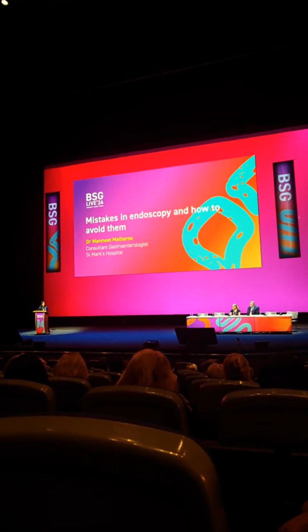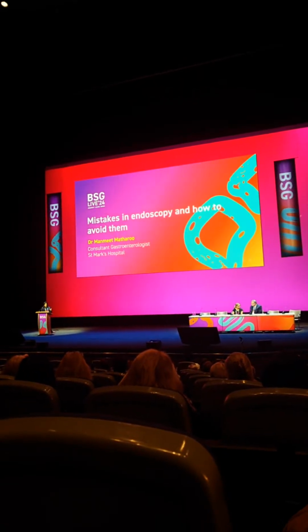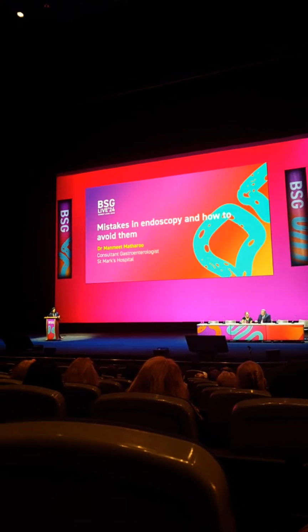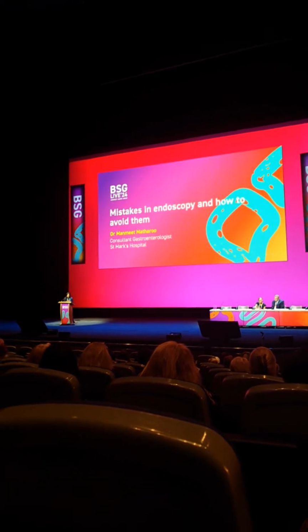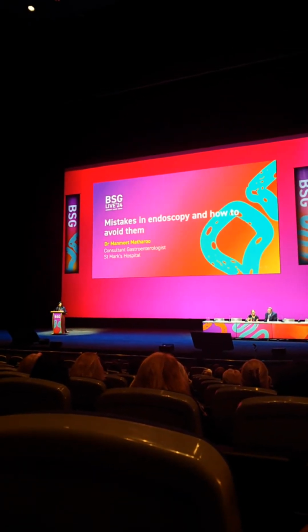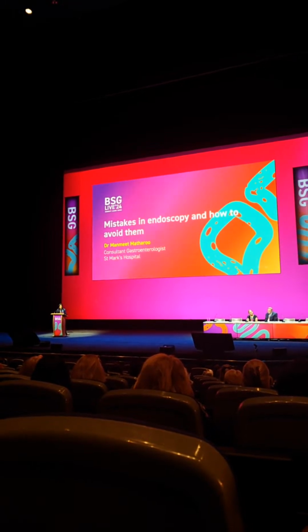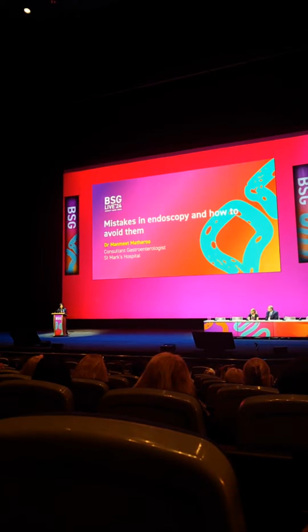Really important question. So as part of my research, we actually timed the length that a checklist took to add onto the procedure, and on average it was about 36 seconds. So the checklist itself didn't add more to the procedure. Where it did add to the procedure is where things hadn't been addressed beforehand. So the briefing needs to be just done once at the beginning of your list, and I guess it's before your list starts, and you can spend as long or as little as you like doing it, but you don't need very long, I think is the key message.